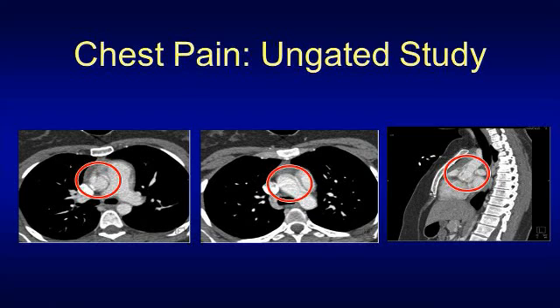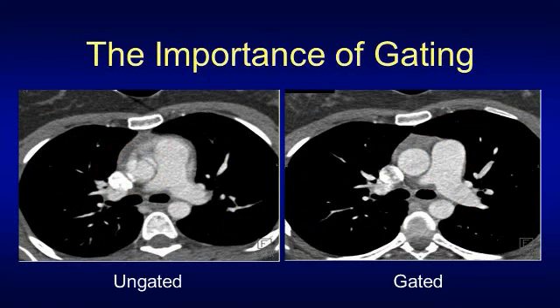We've all seen the pulsation artifact that looks like a dissection. In this case, it very well could be pulsation artifact, but she had a very strong clinical suspicion for dissection and we couldn't be absolutely sure that this wasn't a dissection. So she was imaged the following day with a gated study. Look at the difference — the case on the right: there is no artifact, there is no dissection, and there is no question.